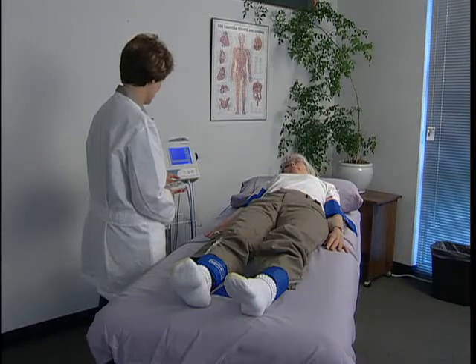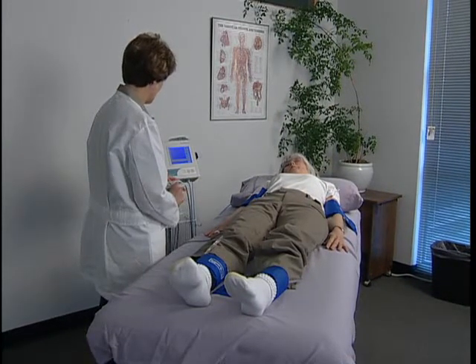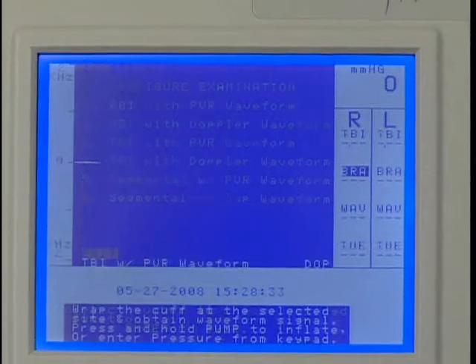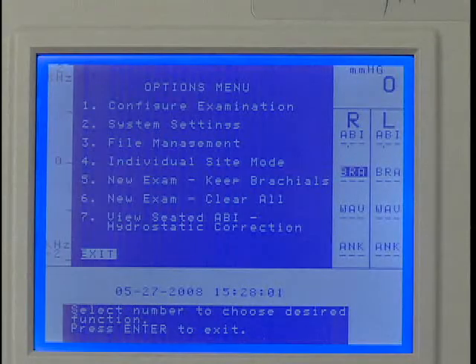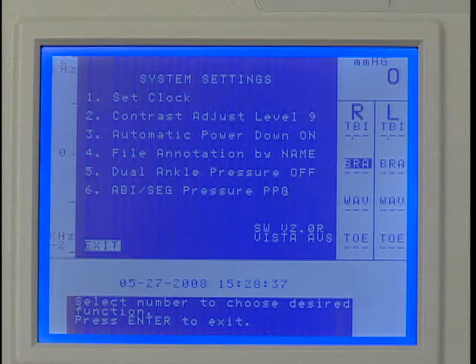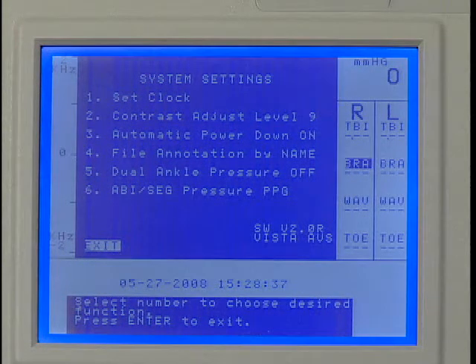To perform a TBI using a PPG probe for pressures and PVR for waveforms, press Enter Menu to open the options menu and press 1. Press 3 to select TBI with PVR waveform. Press Enter Menu to open the options menu again. Press 2 for the system settings. Press 6 to select PPG to obtain pressures, then press Enter Menu to exit.